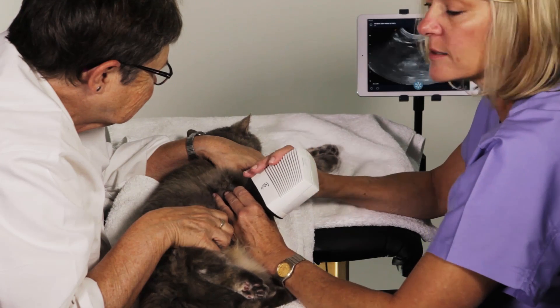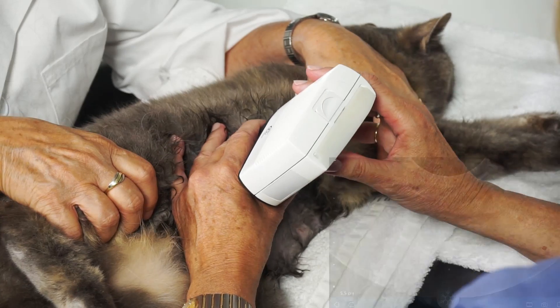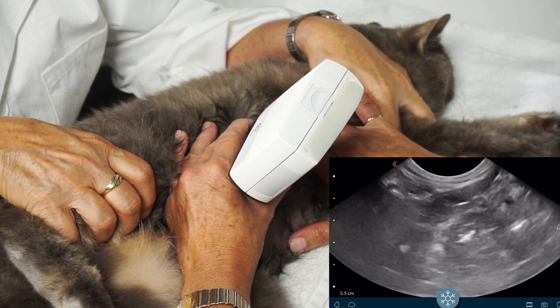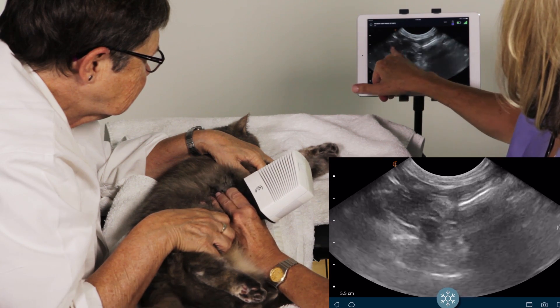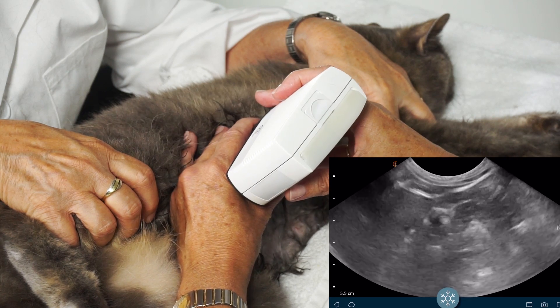Now we're going to scan Smudge's right side, looking at her liver. She's being very patient with us. We've shaved her, and we're on the right side. We can see bowel and loops of bowel here, and there's her gallbladder.